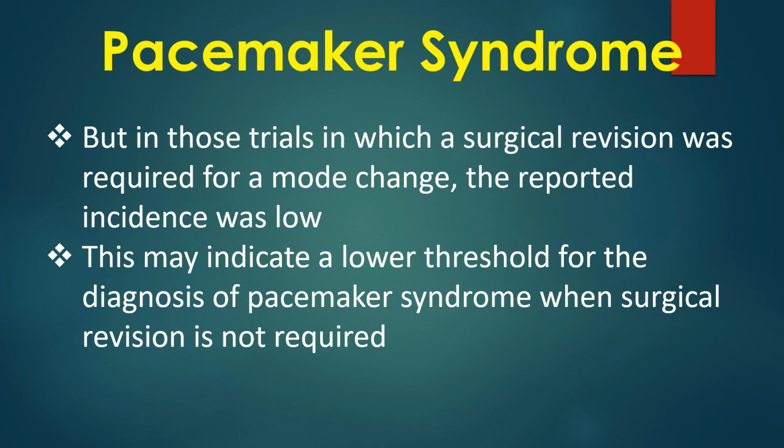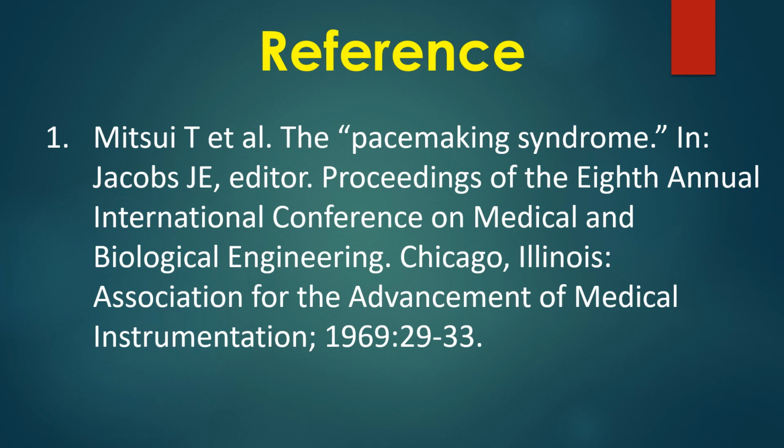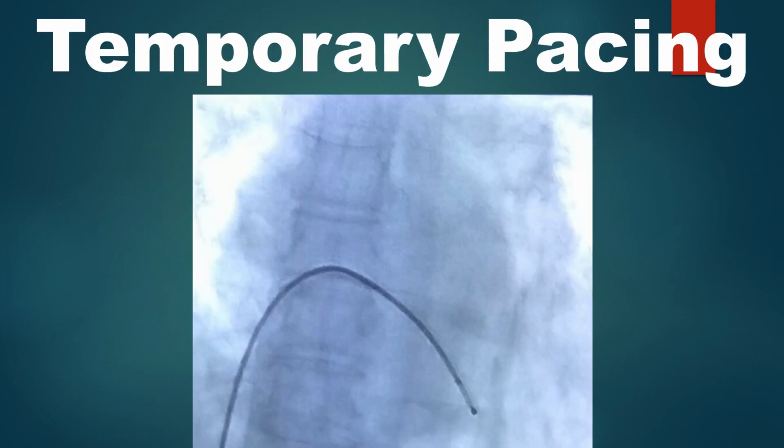But in those trials in which a surgical revision was required for a mode change, the reported incidence was low. This may indicate a lower threshold for the diagnosis of pacemaker syndrome when surgical revision is not required. Here is the reference on the original description of pacemaker syndrome.